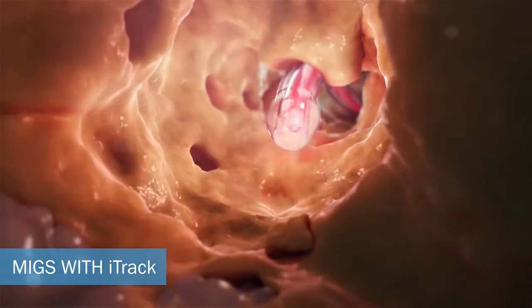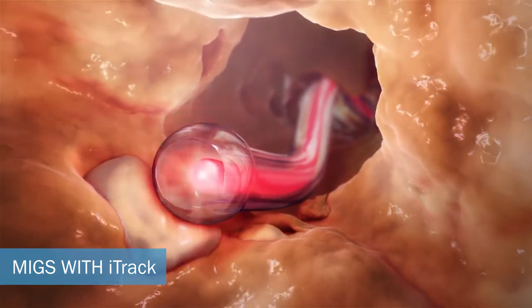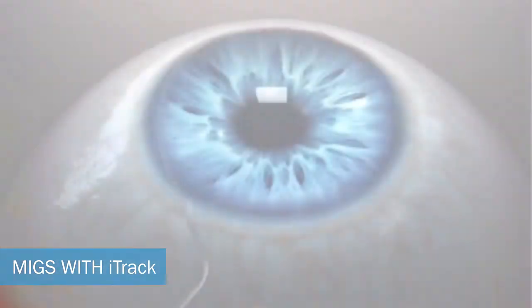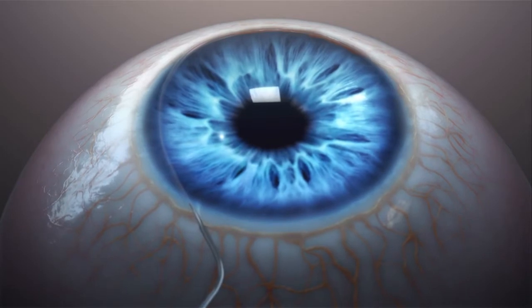Featuring an atraumatic tip and lubricious coating, EyeTrack can be manoeuvred past partially obstructed areas of the canal, while its illuminated tip can be continuously monitored during the procedure.